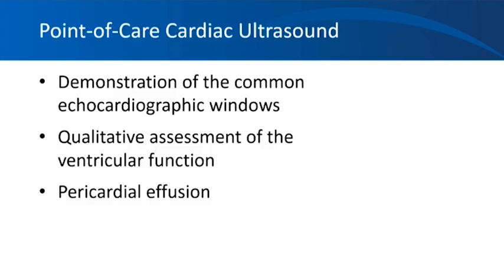So now we'll briefly talk about the point of care cardiac ultrasound. And it involves demonstration of the common echocardiographic windows, qualitative assessment of the ventricular function, and pericardial effusion.